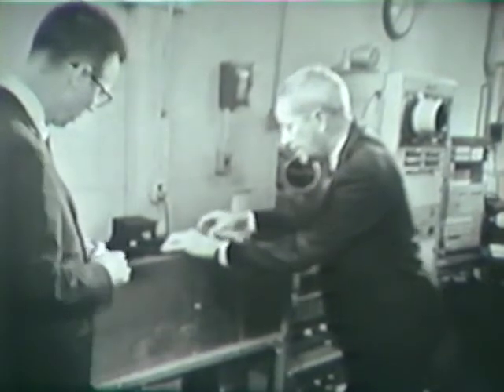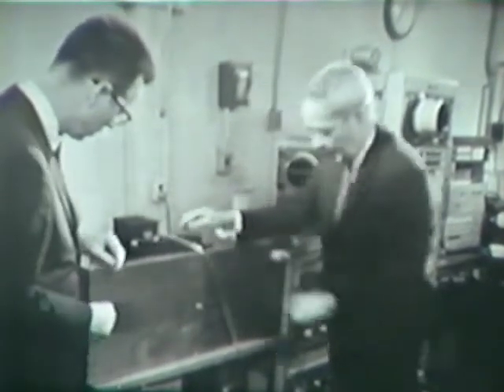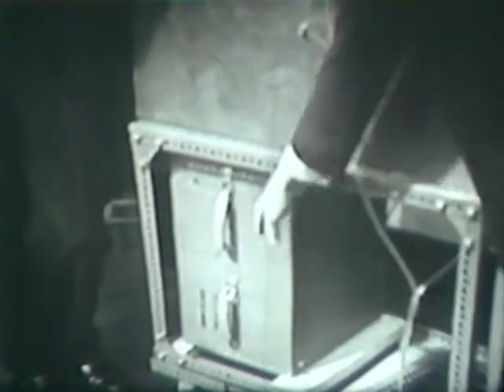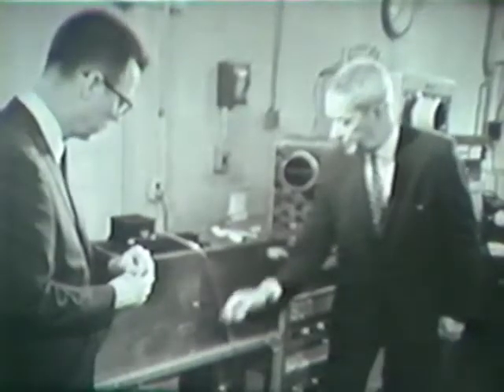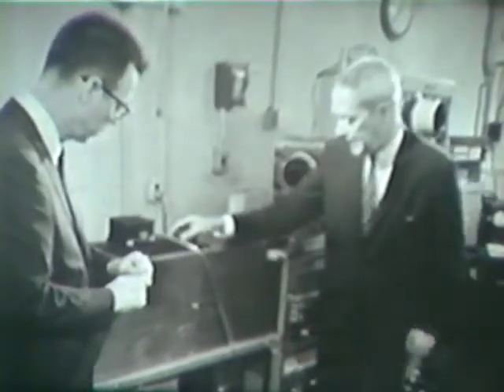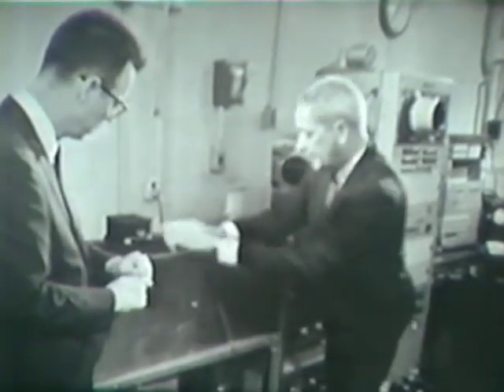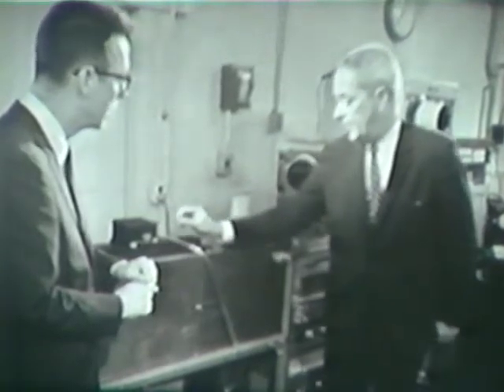There we are. I'll move it over to there. Now, underneath this box is a thing called a flying spot scanner. This is very much like a home TV set. There's a screen in here with a bright spot on it that can be moved around by the rest of the equipment. And there's a lens in here, John, and that bright spot is focused right on the surface of that printed material, and there's a very tiny bright spot there.